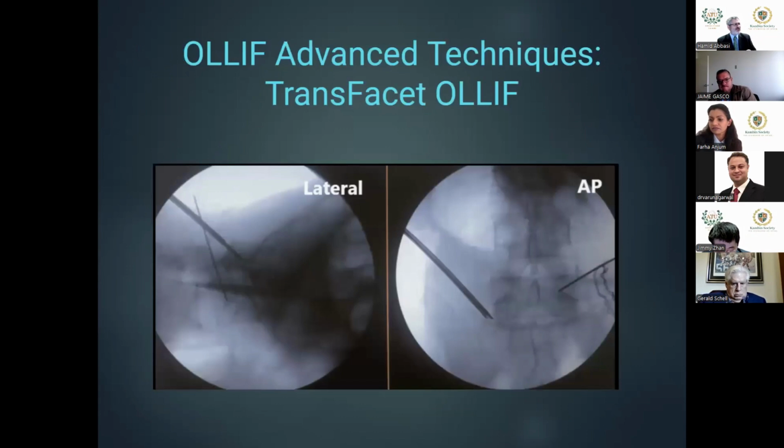Now, one of these advanced cases that we have published a paper about is the Trans-Facet OLLIF. And again, when I started doing OLLIF, in my first 100 cases, half of the L5S1, I had to open it, do it the old-fashioned way. So we created a setup in the OR that lets us go from OLLIF to open in 5 minutes. Now we go in 3 minutes.